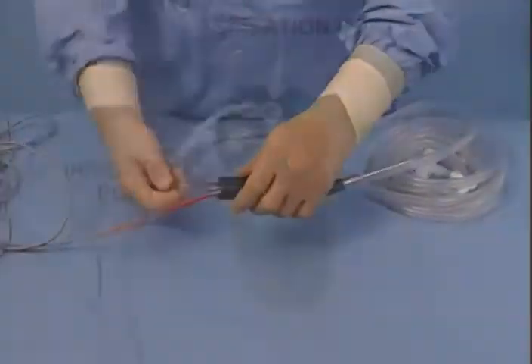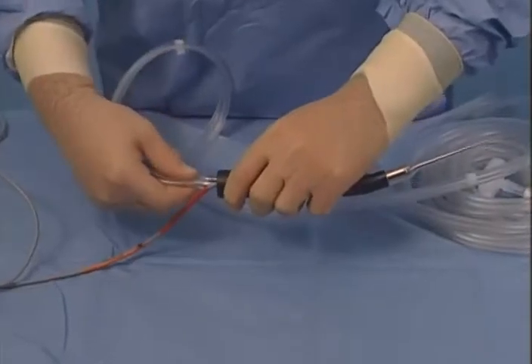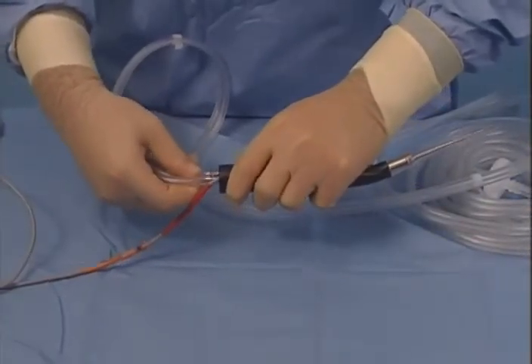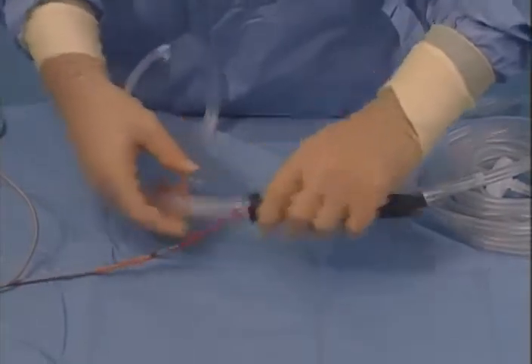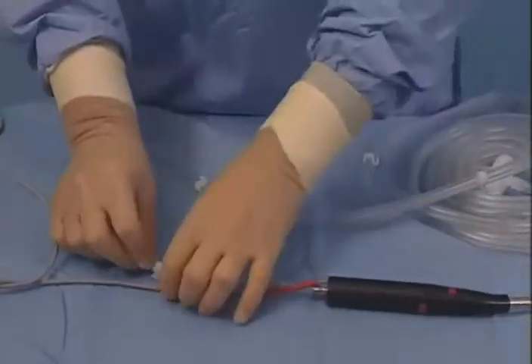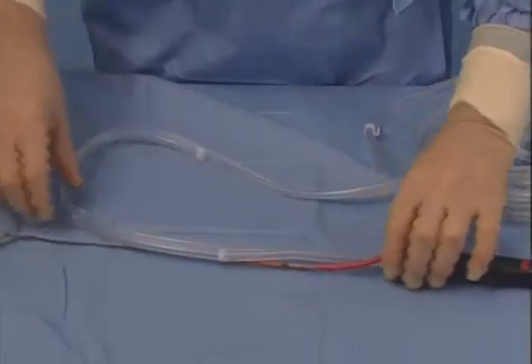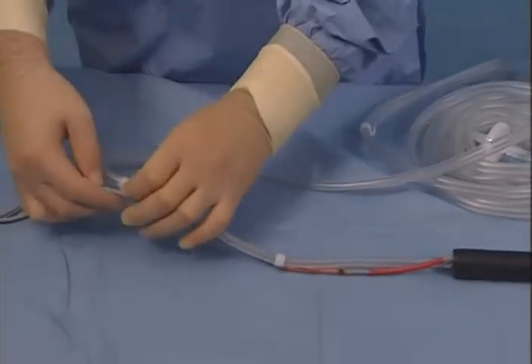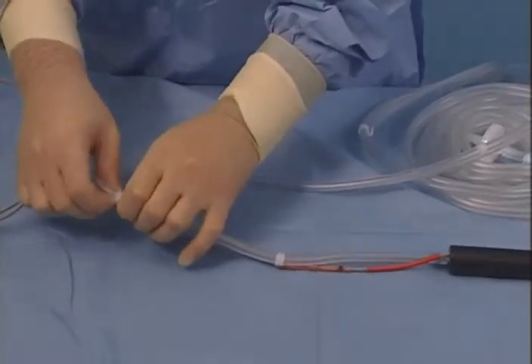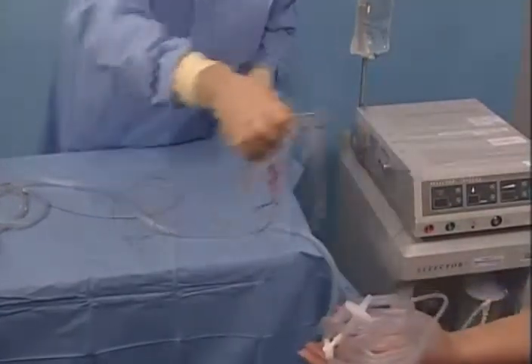Connect the other end of the tubing to irrigation and aspiration ports on the back of the microsurgical handpiece. Using the sterile white hose clips, attach the tubing to the handpiece cable. Place the first clip approximately 2 inches back from the handpiece, and the subsequent clips at about 6-inch intervals. Pass the remaining tubing and the handpiece plug off to the circulating nurse.